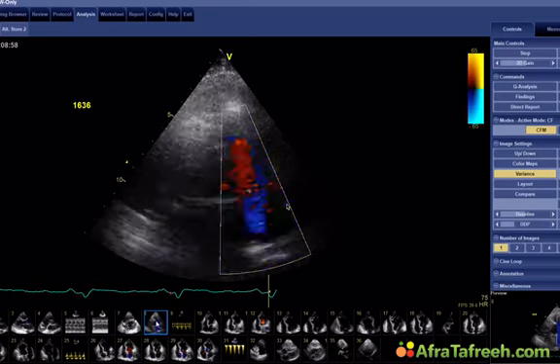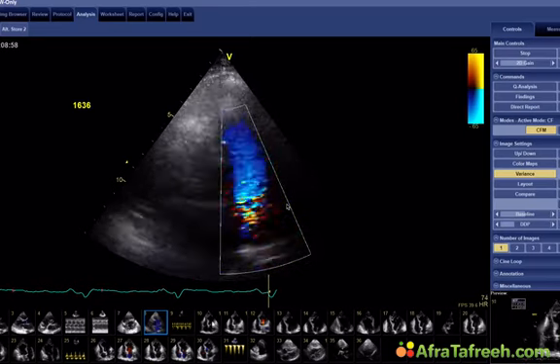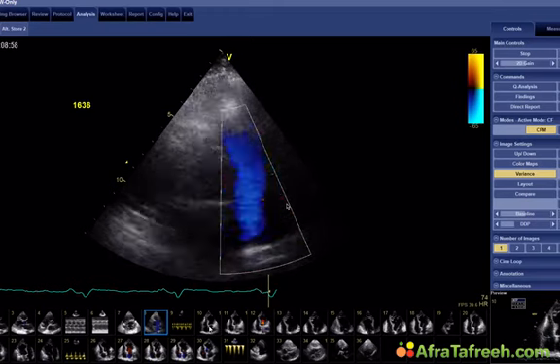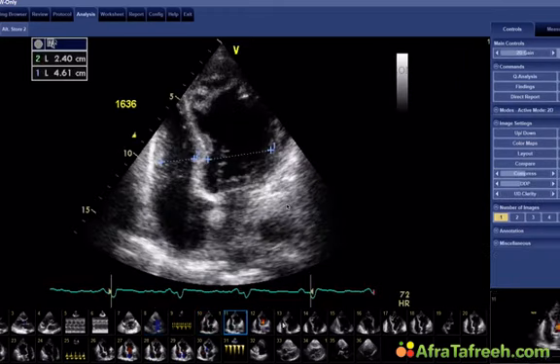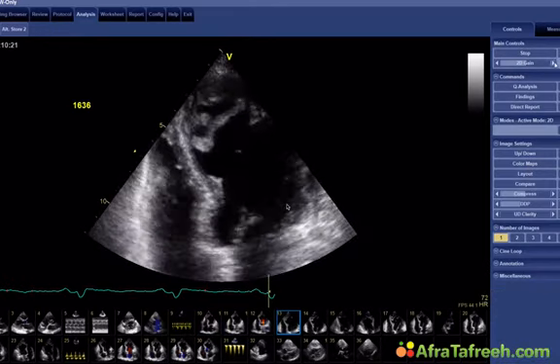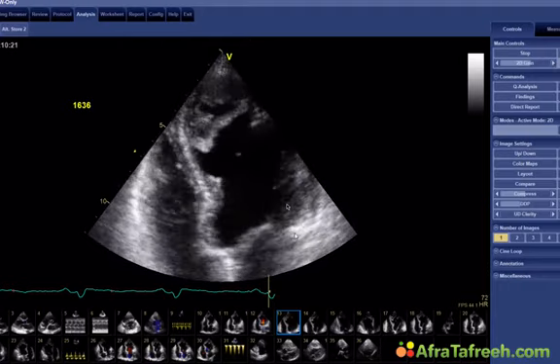Okay. I just see that Guillermo and Heng already have the right diagnosis. I'm not going to tell the others what the right diagnosis is, but once you see this image here, let me see if I can get the moving image. Okay, this is a very abnormal echo.